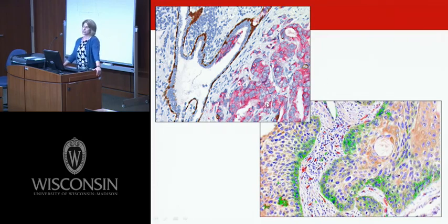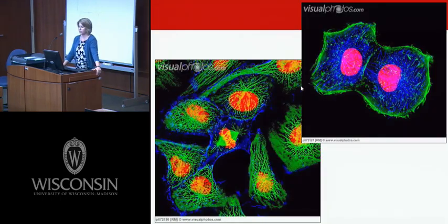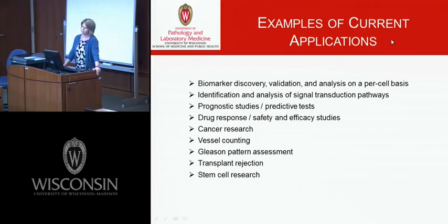Here we have a tissue fragment, and we can see that in this particular image there is a brown stain and a red stain. For those of you that are performing prostate cancer research, this image is probably something that you've seen quite often. Additionally, here is a multiplex image that shows at least 3 different marker types stained in one tissue section. For those investigators that do immunofluorescence, this is a nice image to see that you can have membranous staining, cytoplasmic staining, and nuclear staining all within one image.